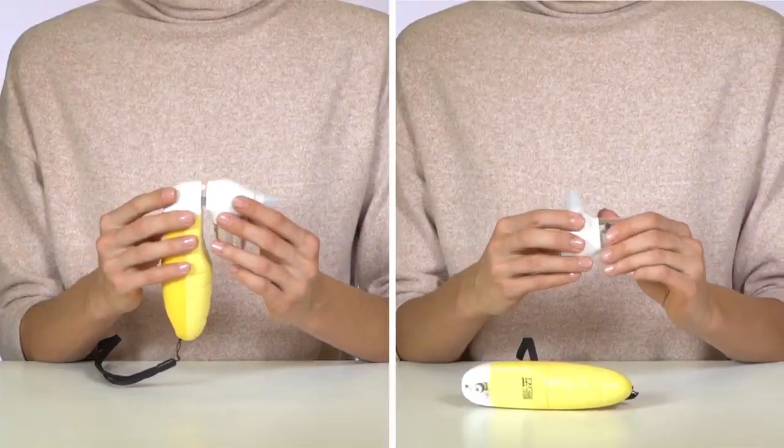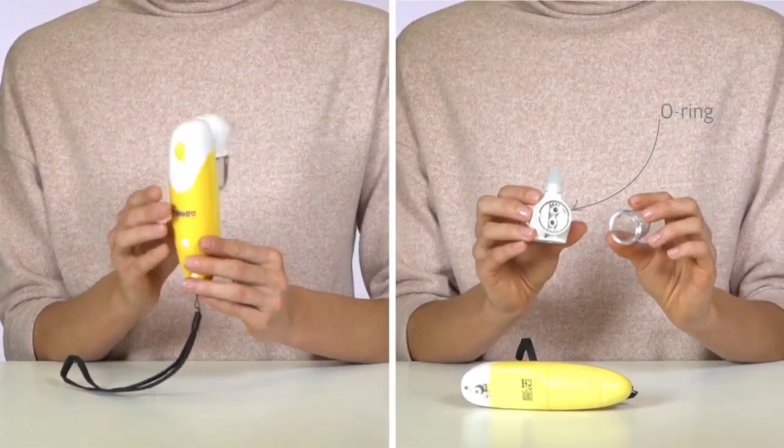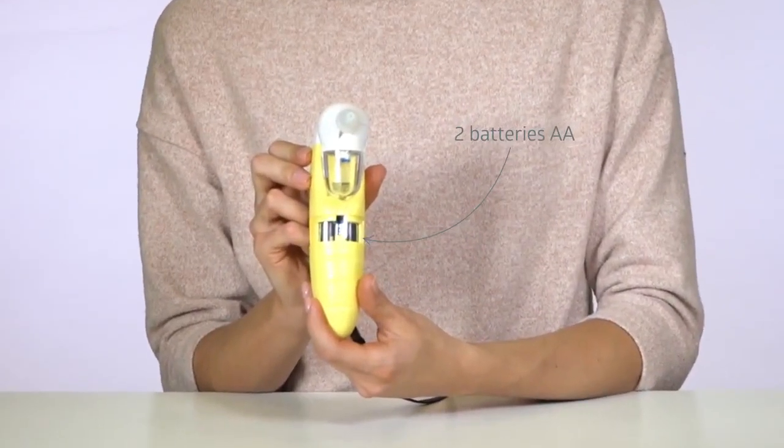Make sure that the nasal aspirator is assembled correctly. Remember the O-ring when assembling it. The device is powered by two standard AA batteries — convenient and safe.